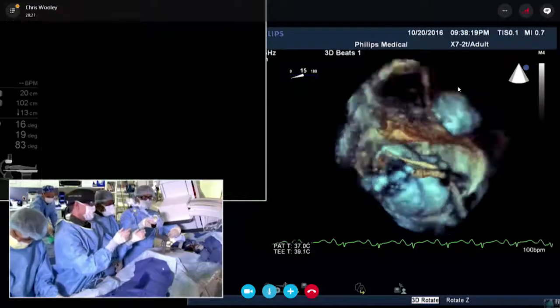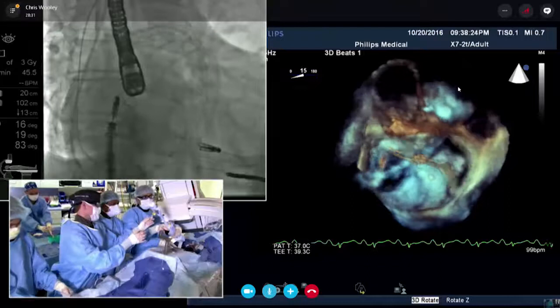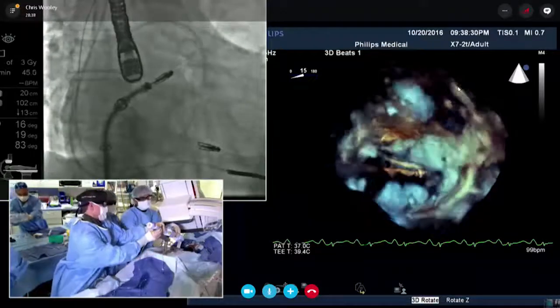Hey, Saibal, can I ask you a question for discussion? Sure. So what's the acceptable gradient, do you have a threshold for your gradient before you decide on the next clip? Less than 4.